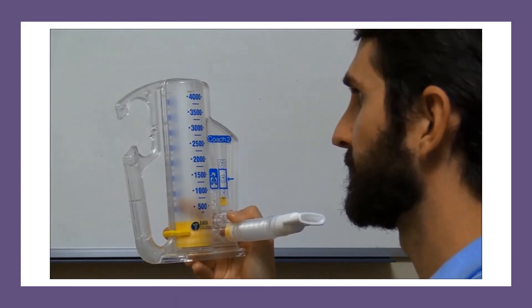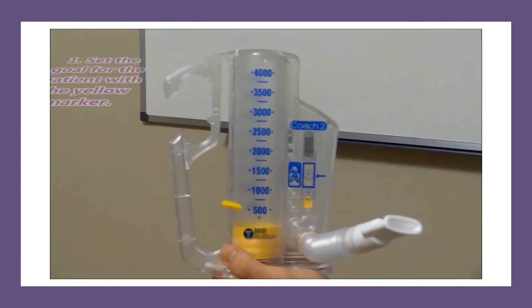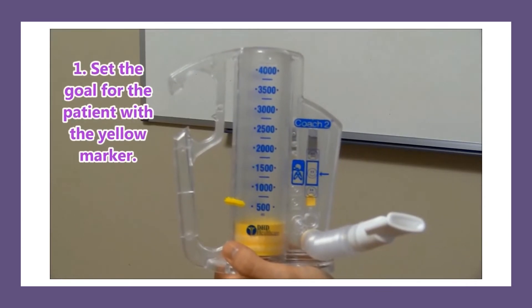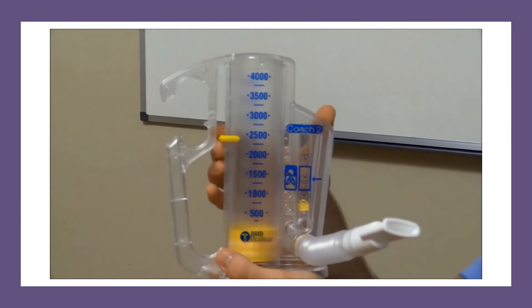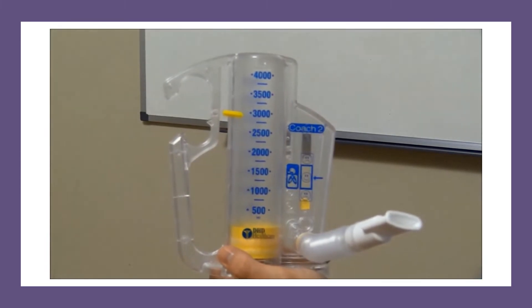Now let's look at the right way to use an incentive spirometer. First, what you want to do is set the goal for the patient with the yellow marker, so they know where they need to get whenever using this incentive spirometer.